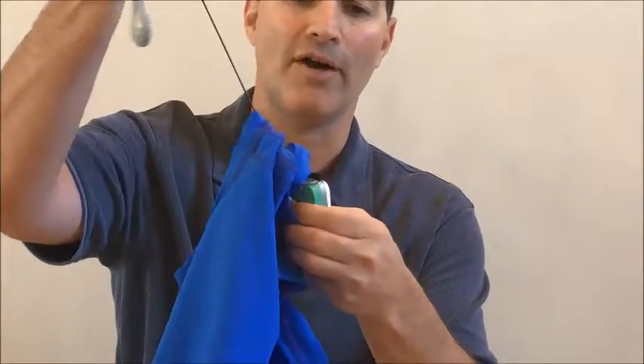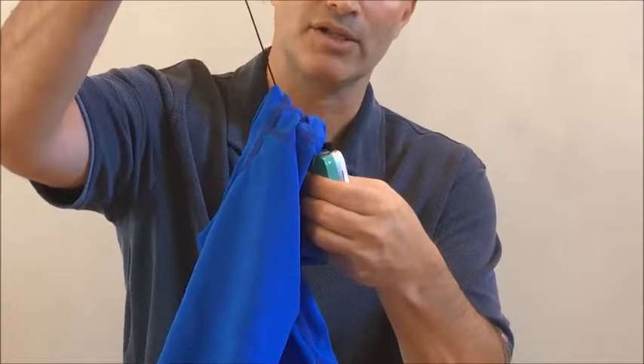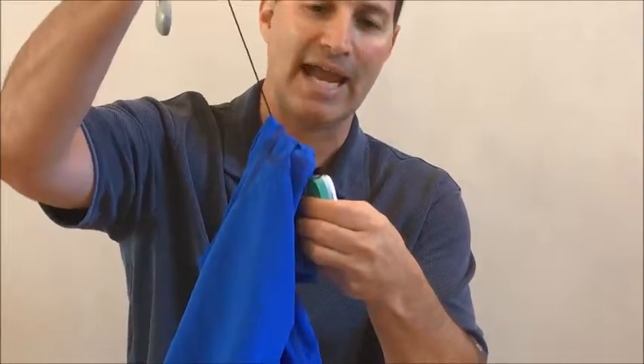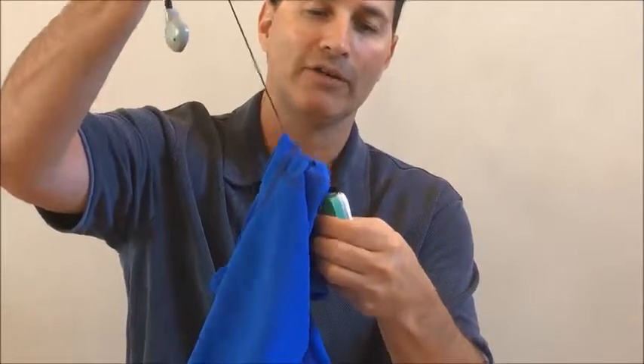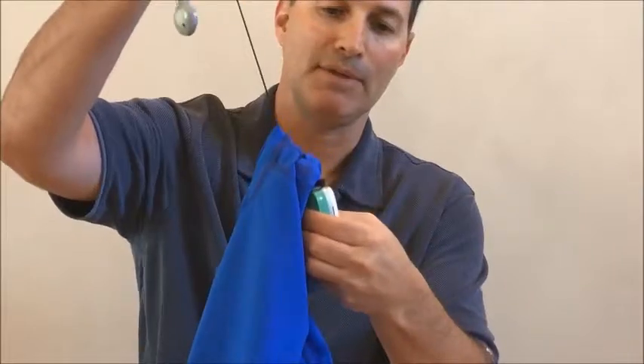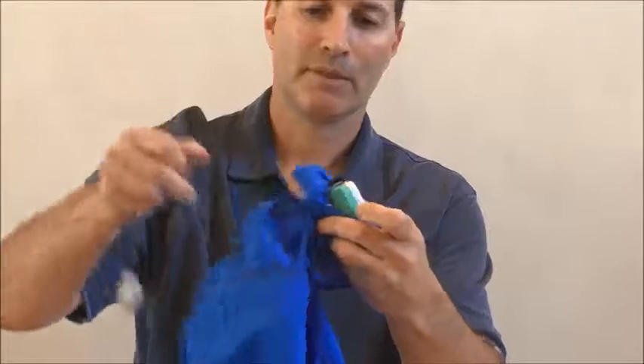The shirt takes all the pressure off that connection point, allowing it to stay connected to your processor. So if you're ever doing any sports or water activities and your cord gets snagged, it won't come off the processor and you won't lose the cord and headpiece. As I keep yanking, there's no pressure on disconnecting this point here. That's how one of the major features of our shirt keeps your processor nice, secure, and protected.